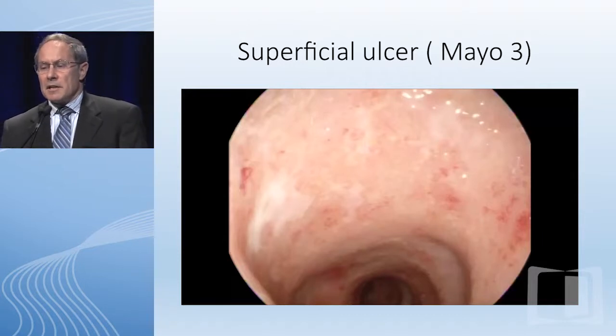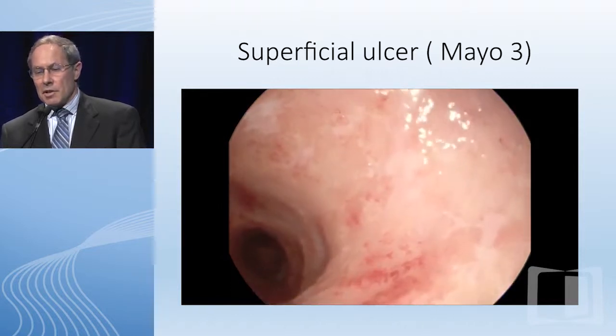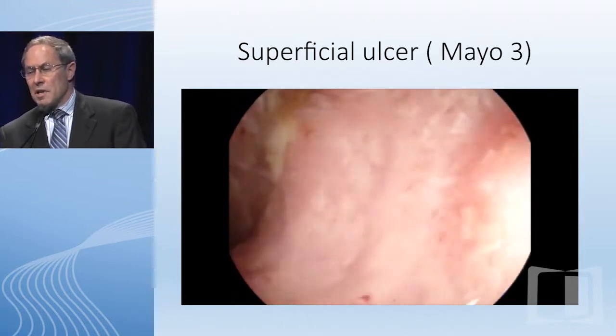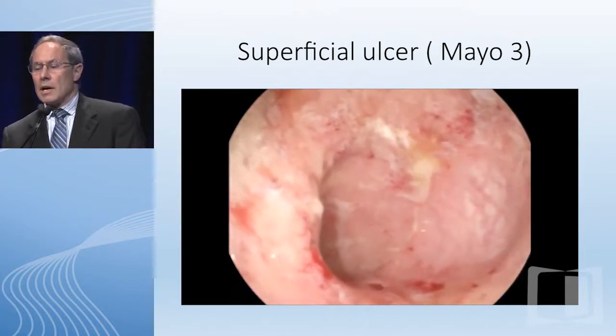And then this example is a little more advanced and shows moderate ulceration, patchy ulceration. Again, another patient on biologic therapy, improved, but not in remission, certainly not in clinical or colonoscopic remission. There's some partial healing there, but continued active disease.